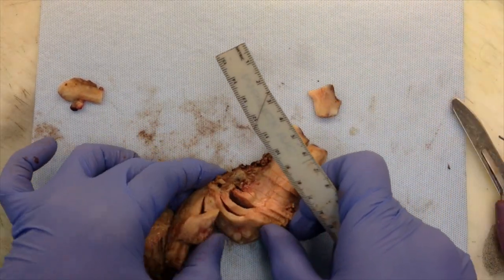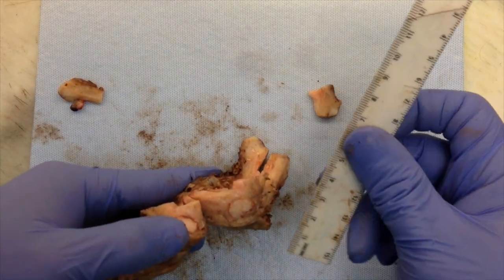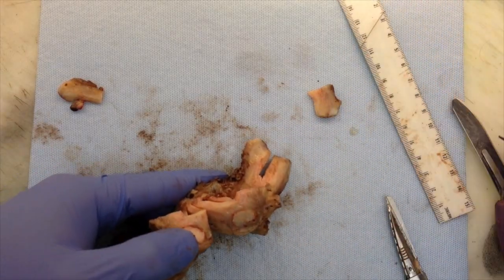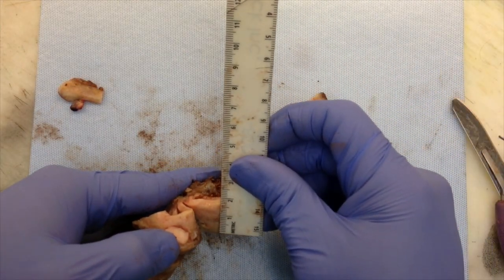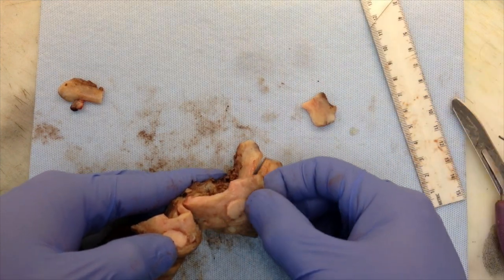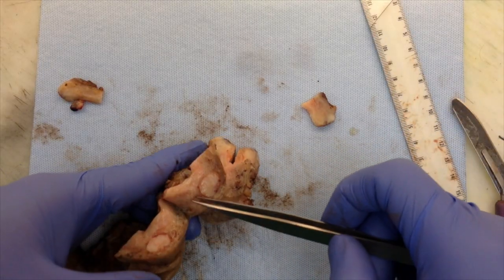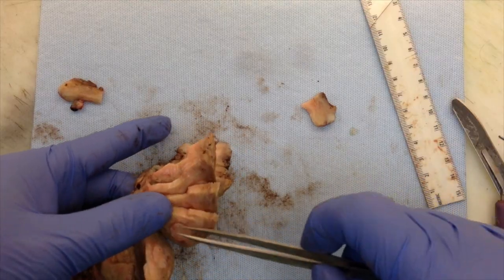So then we're going to take an endometrial thickness measurement. And so endometrium is usually just a thin layer, usually 0.1 cm. And then the myometrial thickness here is about 1.6 cm. And we'll describe the myometrium and see there's these intramural nodules, which is nodules within the muscle wall. So there's multiple.